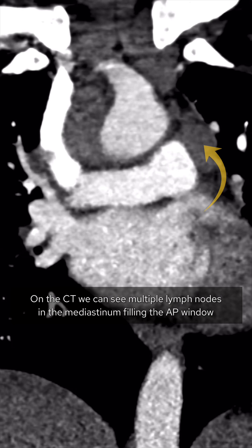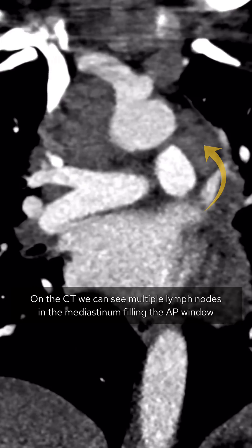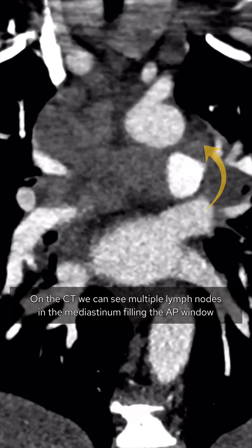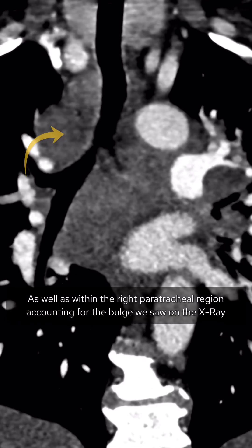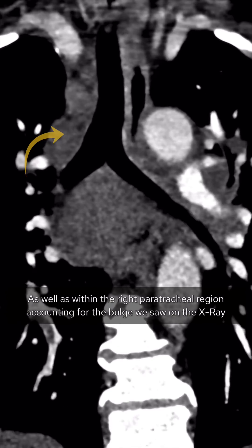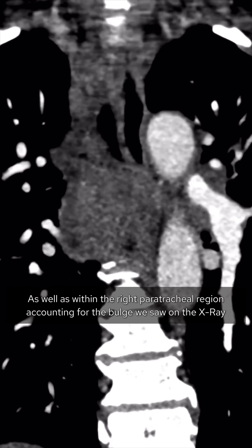On the CT, we can see multiple lymph nodes in the mediastinum filling the AP window, as well as within the right paratracheal region, accounting for the bulge we saw on the X-ray.